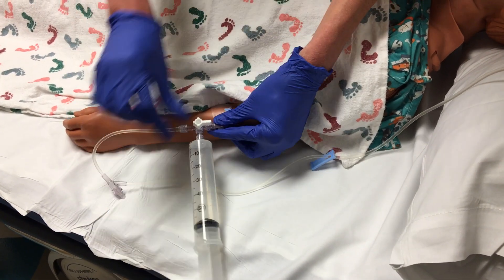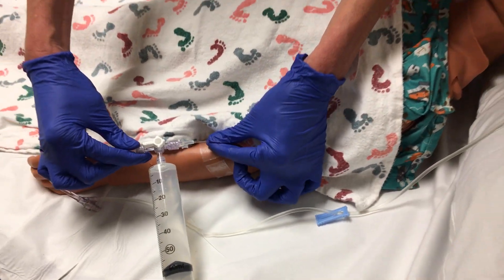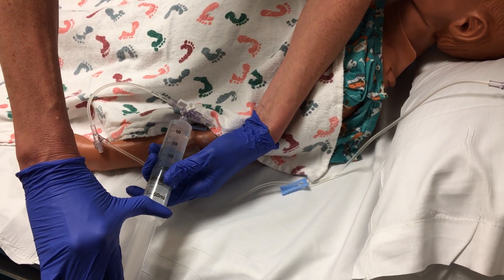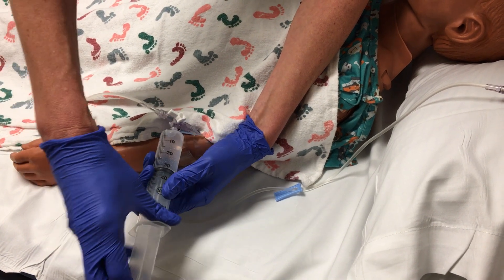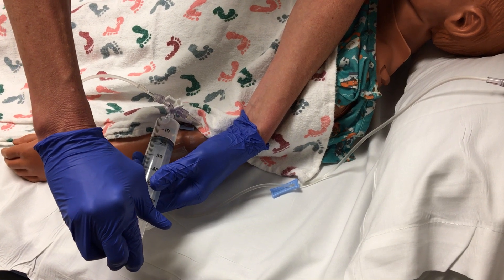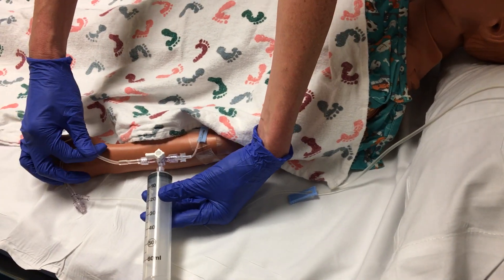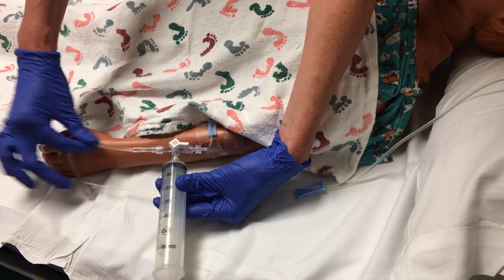As much as your syringe will hold, and then you turn the toggle off to your fluids, on to your patient, and push with a smooth quick motion into your patient. You will normally be needing to do this more than one time, and then you would just turn it back off to your patient, on to your fluid.